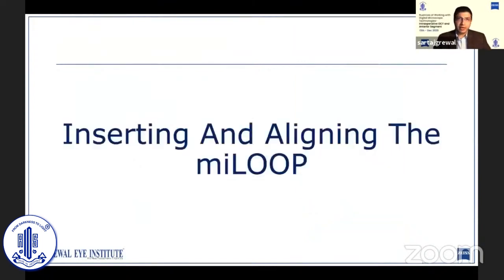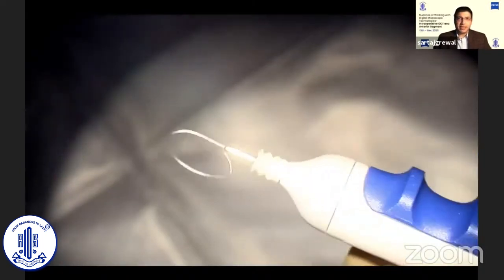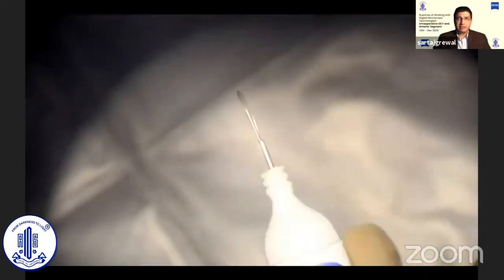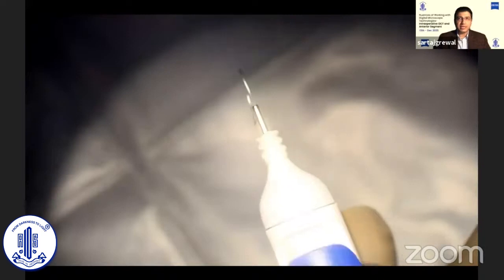Let's talk about how to use the MyLoop. This is the recently refreshed MyLoop that has a compressible rubber sleeve at the neck of the nozzle. It's very convenient to operate with just one hand, and as can be seen here, it has a very smooth mechanism of movement.